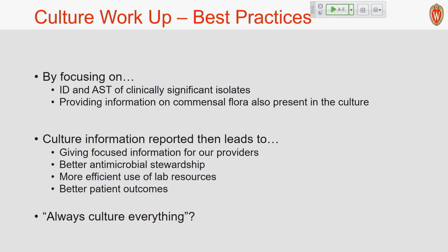So I think, regardless of how you decide what is important, what you are going to work up, what you are going to do susceptibility on, it's really to have some data-driven plan on how you determine what's most likely significant. And really, the thing we don't want to do is always work up everything. I do remember that, and it was a big headache, and we felt, as microbiologists, we want to do it all. And that's how it was when I started out in the 80s. We just worked a lot of stuff up.